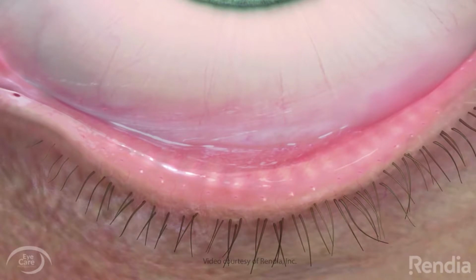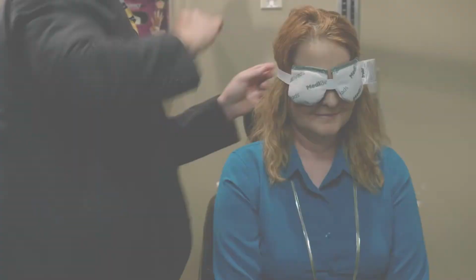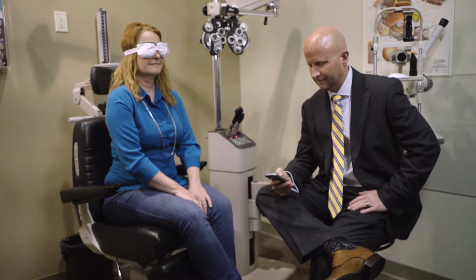Before expressing, look at the gland orifices to look for any patent or capped glands. Now, let's talk about meibomian gland expression. It is important to heat the glands prior to expression. I use a Bruder mask here. Warm the mask for 20 seconds in the microwave and have the patient wear the mask for 10 minutes prior to expression.